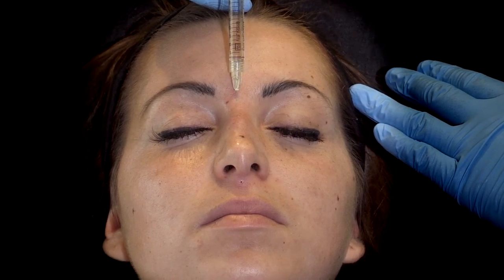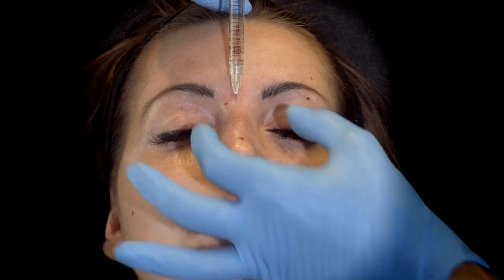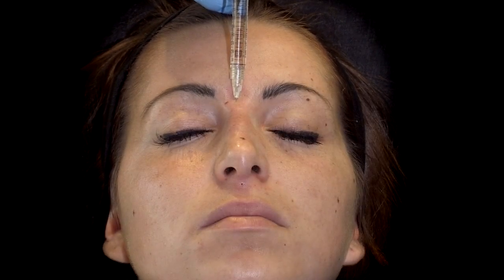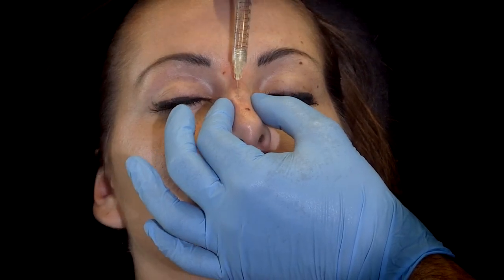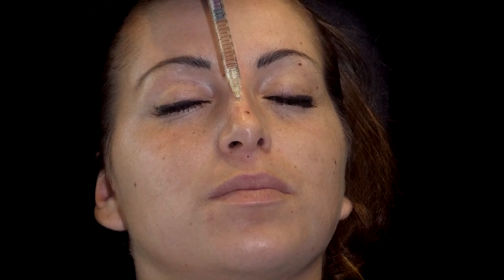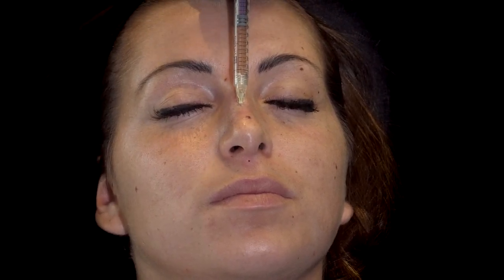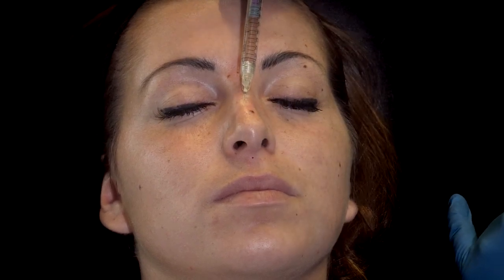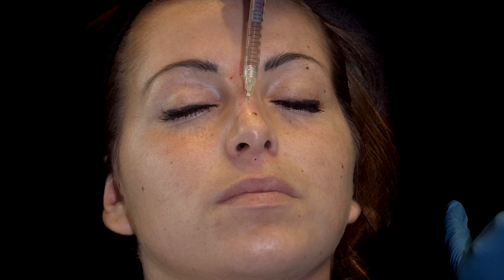The second step is then to correct the naso-frontal angle to hide the hump. Again, a medial injection is safer. Same safe injection to inject on the supratip to hide the lower part of the bump with 0.2 cc of the same HA gel.